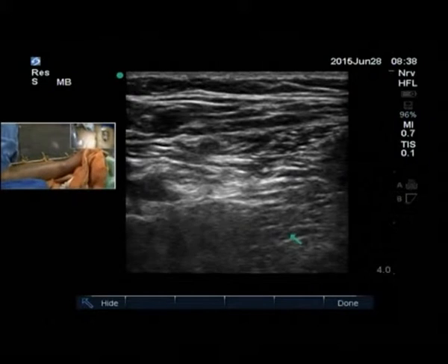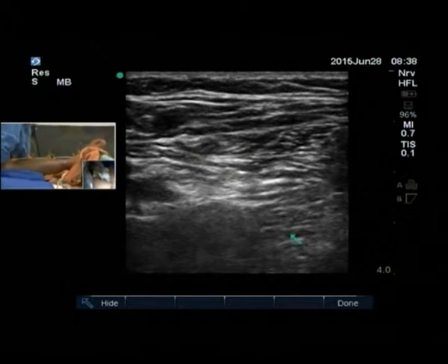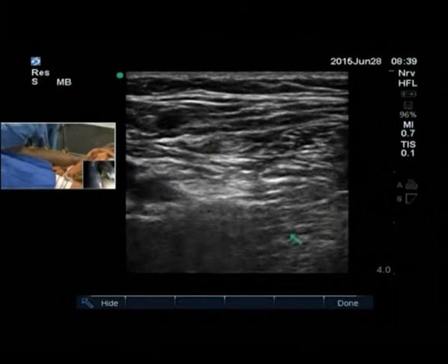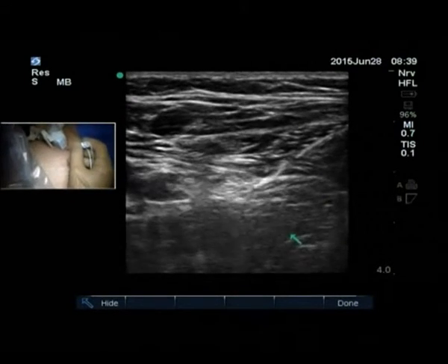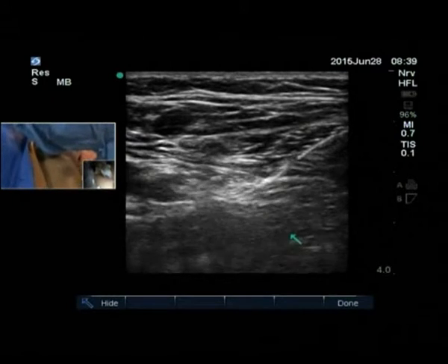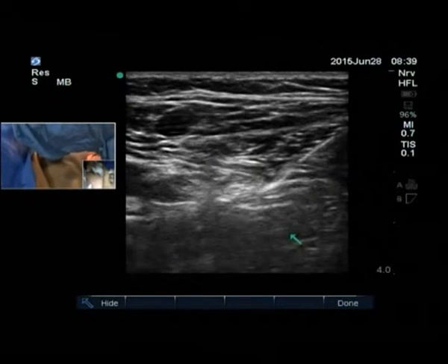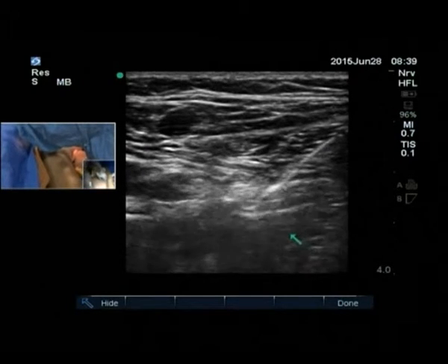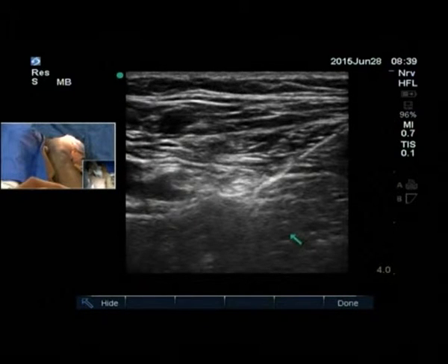Are we using the HNS12? The stimulator is reading 0 right now. We turn it up? It's up, I see. This has to be here. This PNS. So this is where I am. Dr. Sandeep, is that HNS12? Yeah, it's HNS12. The positive electrode is fine? Yes, sir. Ah, it's disconnected. Now turn down the stimulation. Turn it down, yeah. Okay, now it's working.